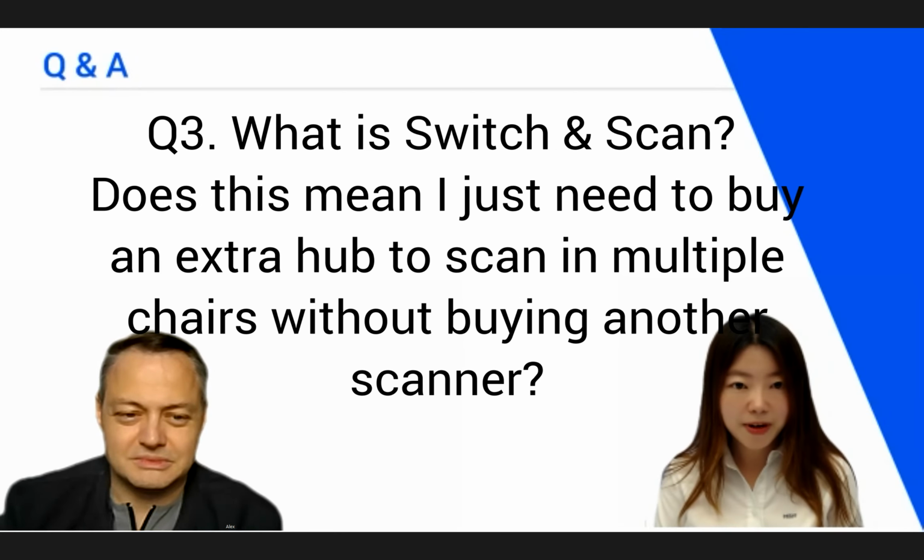Okay, question number 3. What is switch and scan? Does this mean I just need to buy an extra hub to scan in multiple chairs without buying another scanner?